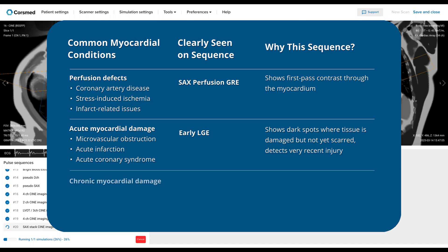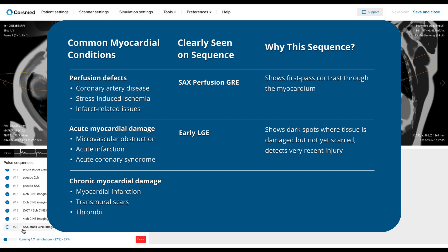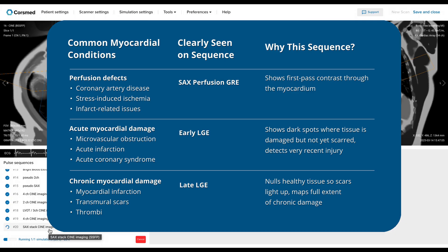Finally, we look for chronic myocardial damage. This includes myocardial infarction, transmural scars, and thrombi. Such late-stage damages are best seen with late gadolinium enhancement sequences. These null the signal from healthy tissues so that scars appear bright, showing us exactly how large and deep the damage is. This information is critical to determine if revascularization will work.